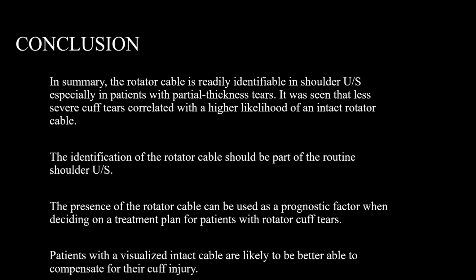The presence of the rotator cable can be used as a prognostic factor when deciding on a treatment plan for patients with rotator cuff tears. Patients with a visualized intact cable are likely to be better able to compensate for their cuff injury differences.